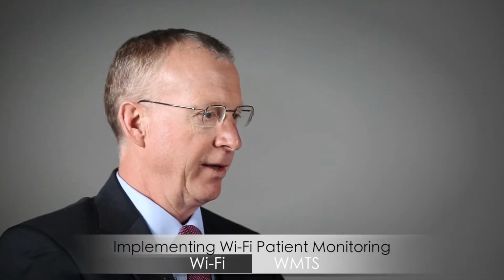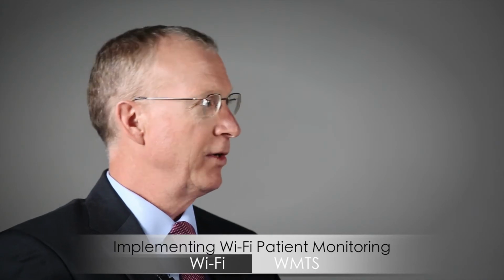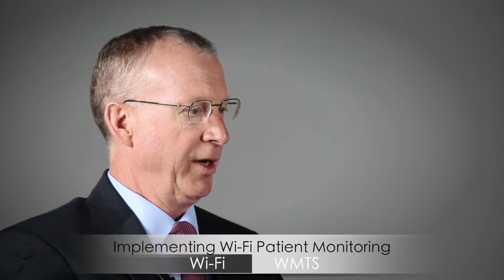Then I could turn back to the organization and say, all right, here's what you need to meet your clinical requirements based upon where the patient's going to travel. Here's technically the requirements. Then they could go back to their integrator or whoever they use and say, based upon our existing architecture that we have, we need to add or remediate this amount to meet these requirements.